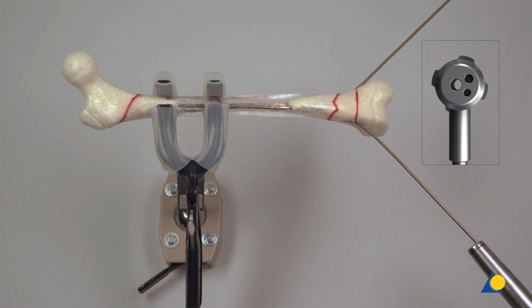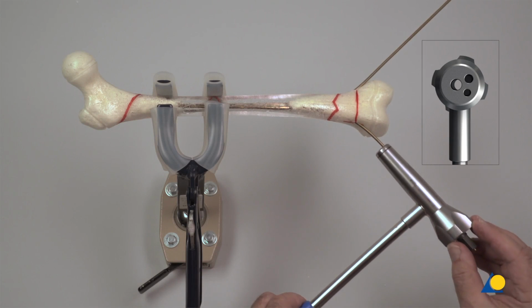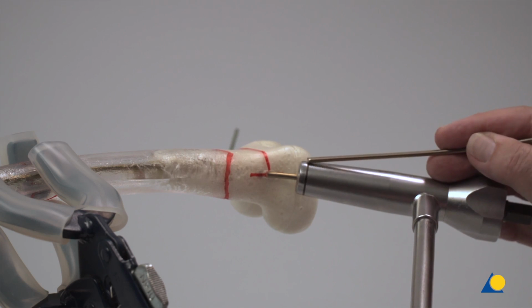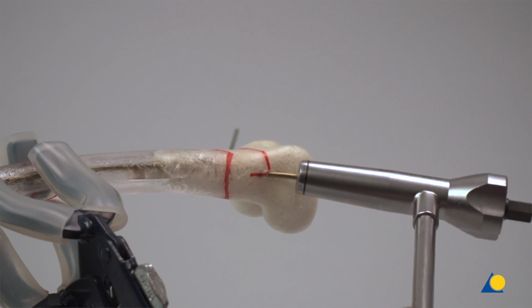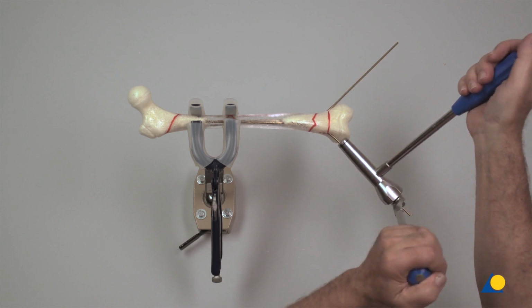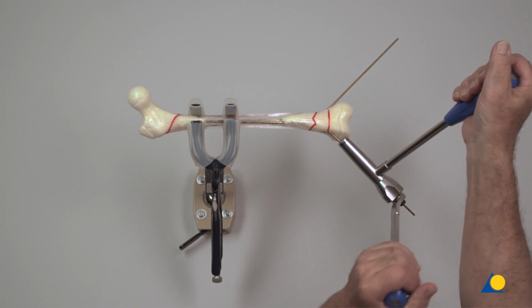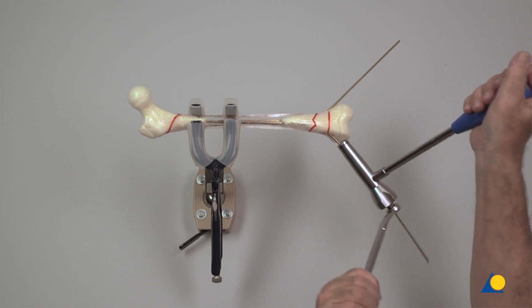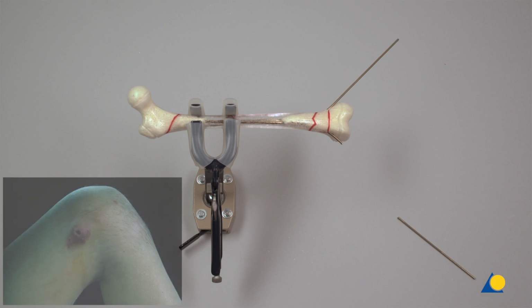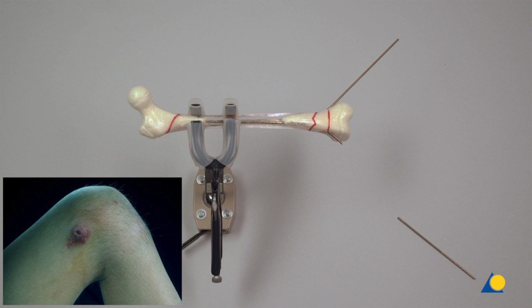The appropriate marked opening cutter sleeve is slid over the nail. The black mark on the cutting sleeve indicates the point at which the nail will be cut. The handle is placed on the cutting bolt. With a firm grip, the handles are moved towards each other in one fluid motion to cut the nail. Excessively long nail ends result in pseudobursa formation and prevent free flexion of the knee. They can also perforate the skin and cause infections.